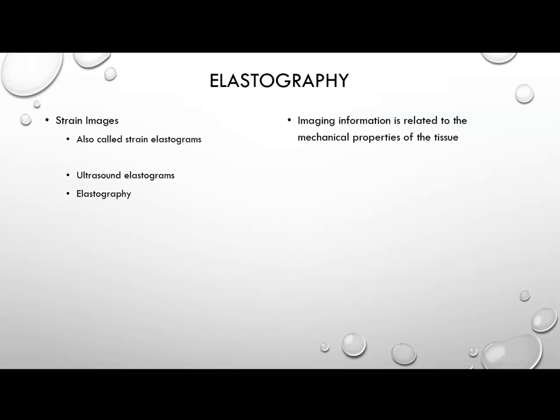Elastography is a technique whereby we can apply a force to a tissue and see how much that tissue deforms. There are several ways we can apply a force, but that deformation of the tissue is known as the strain of the tissue.